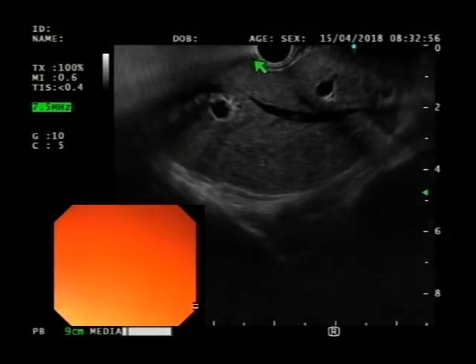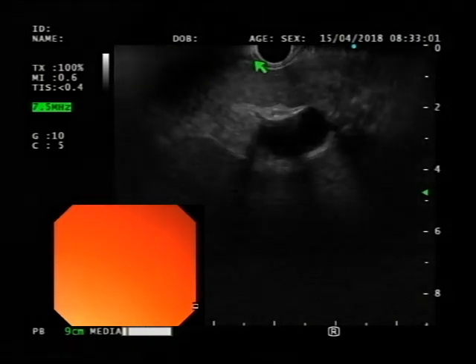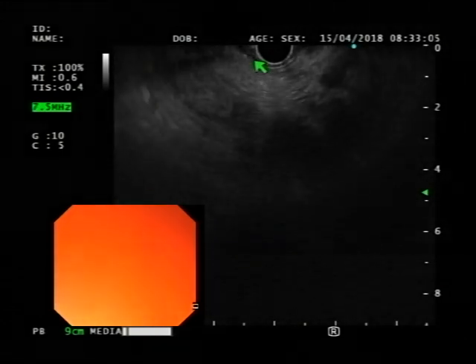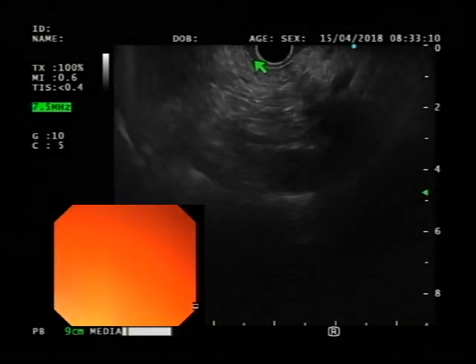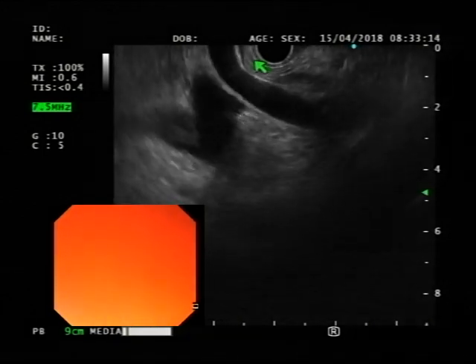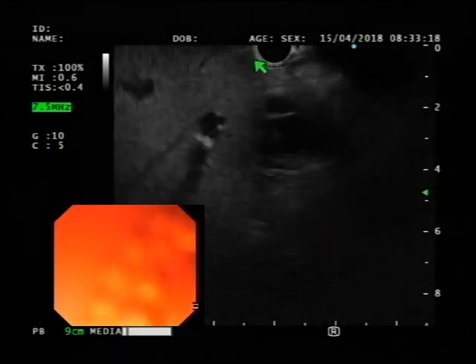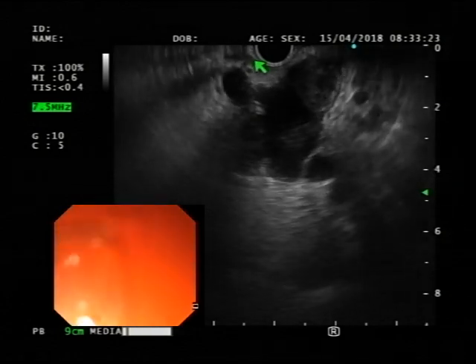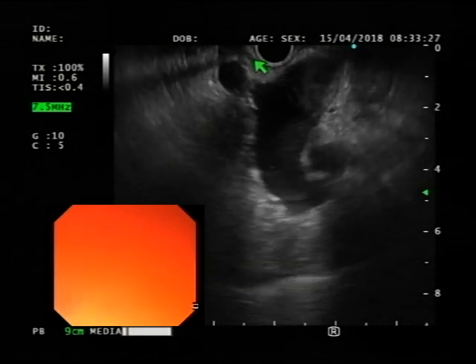Okay, so right here, rotate it to the right. Keep rotating. Good, to find the aorta. Keep going. Okay, go back a little bit. What was there? Right there. Okay, hold on, stay. Khalid, you see that clot again?